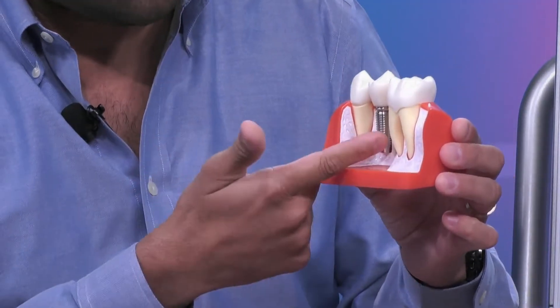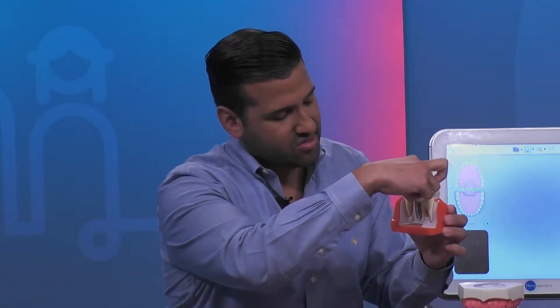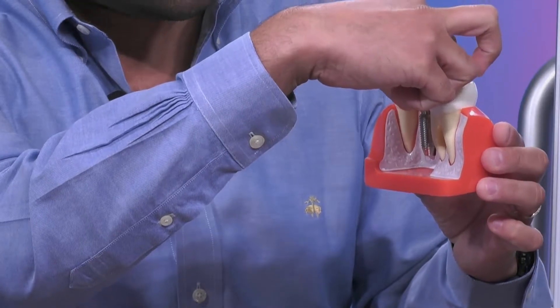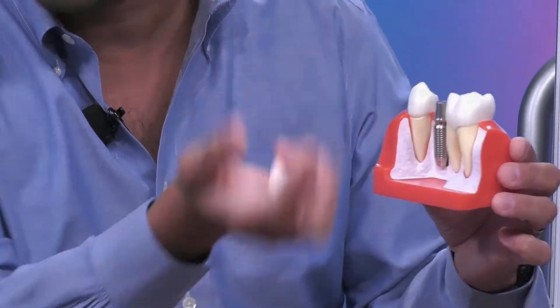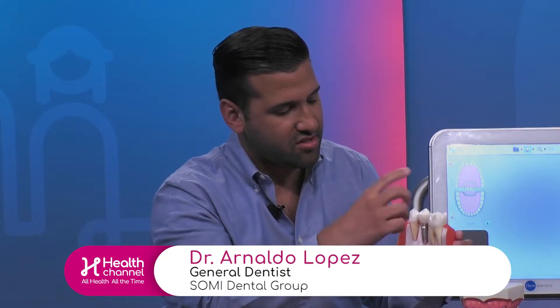This is cemented onto the implant, but you need something that connects the implant to the actual crown, which is this little guy right here. So this is called an abutment — this is basically just the piece that screws onto the screw. So that goes under, and it gets attached onto here.